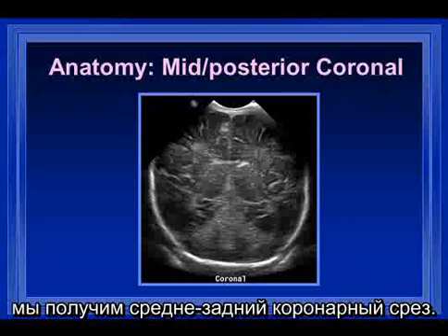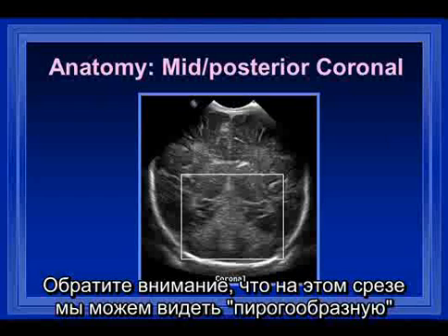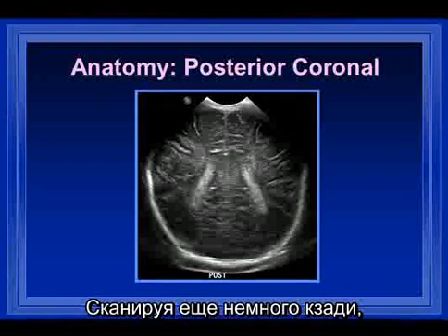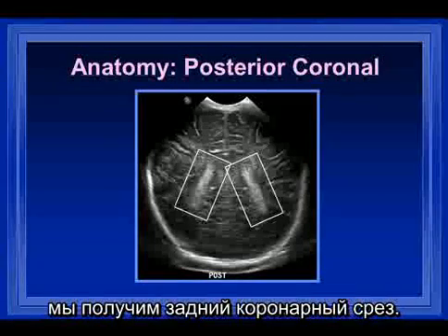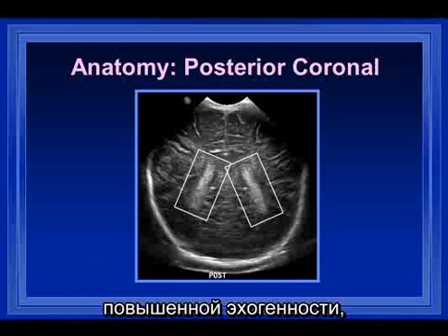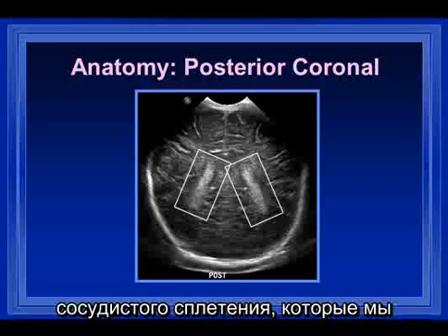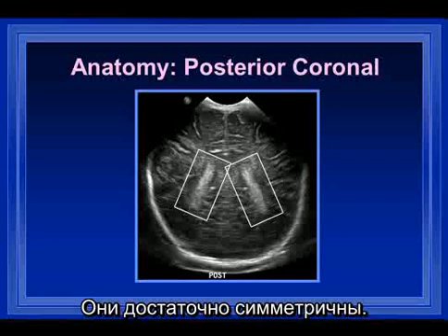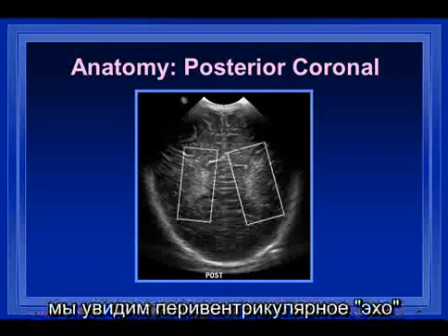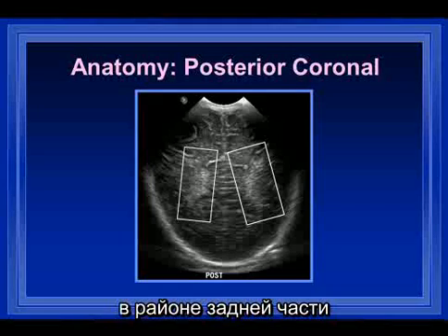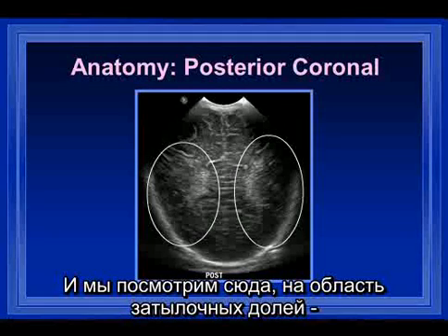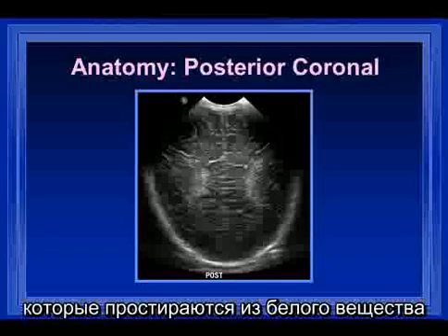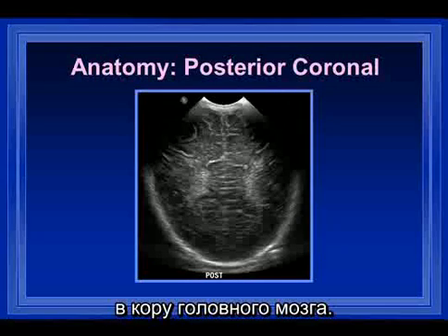A little bit more posteriorly we get to the mid-posterior coronal view. Note in this view the pie-shaped area of bright echogenicity representing the cerebellum. Further back at the posterior coronal view, we see bright areas of increased echogenicity that are the glomera of the choroid plexus, which are generally quite symmetric. Even further posteriorly, we see the periventricular blush around the posterior portions of the brain in the occipital lobes, representing vascular markings and neurons coursing from the deep white matter to the cortex.